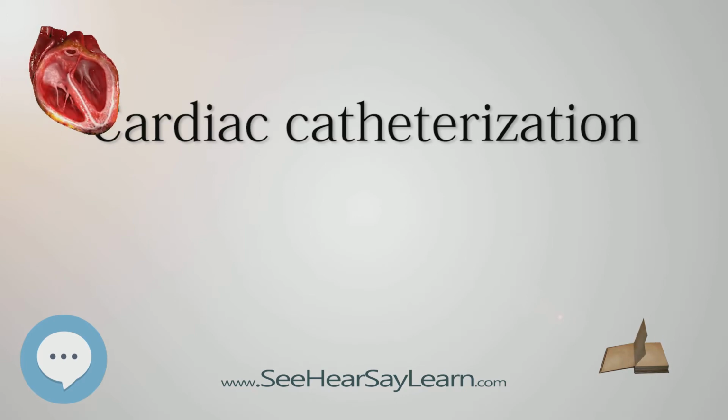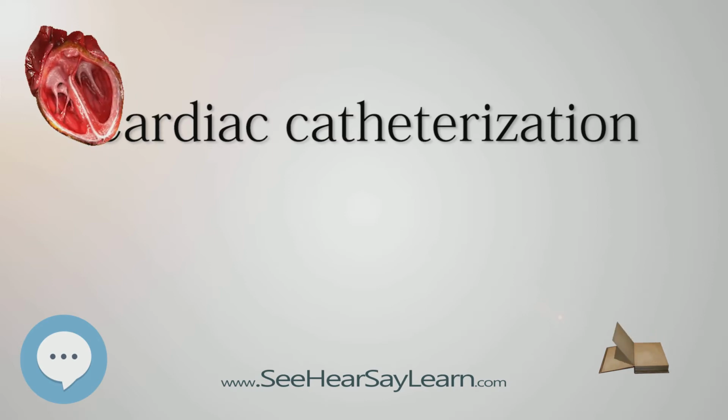Catheterization of chambers and valves. Catheterization of cardiac chambers and valves may be performed at the same time as a coronary catheterization, and may also involve nearby major vessels, such as the aorta. It is the main method of cardiac ventriculography, another being radionuclide ventriculography, whose use has largely been replaced by echocardiography.